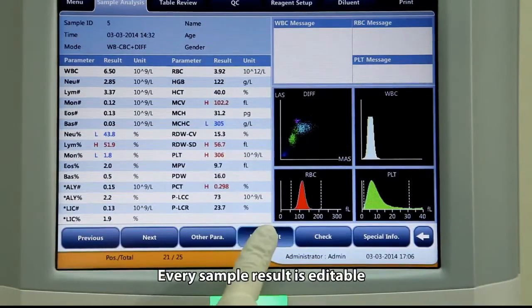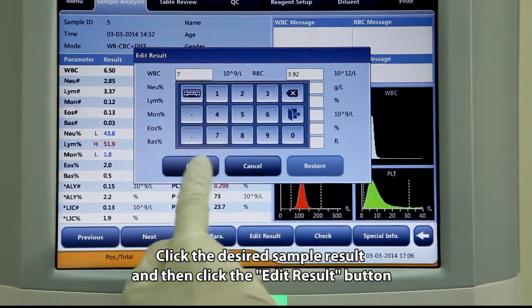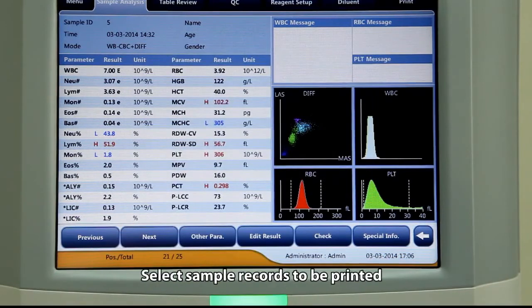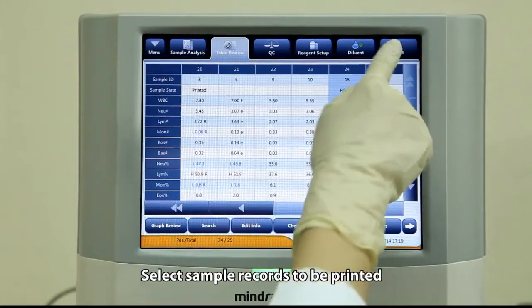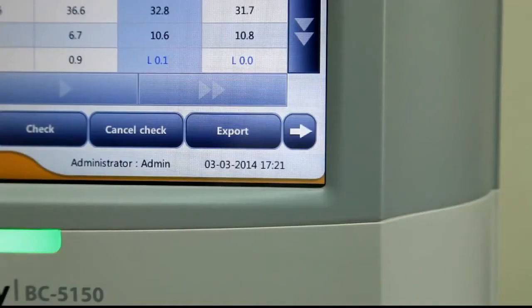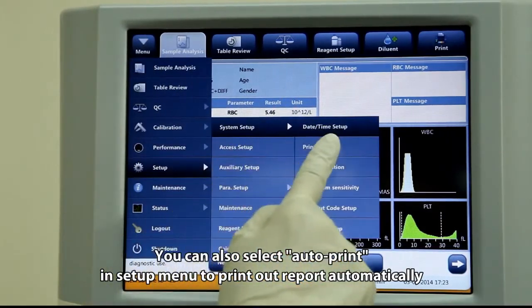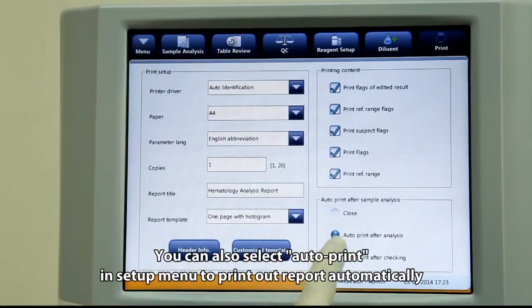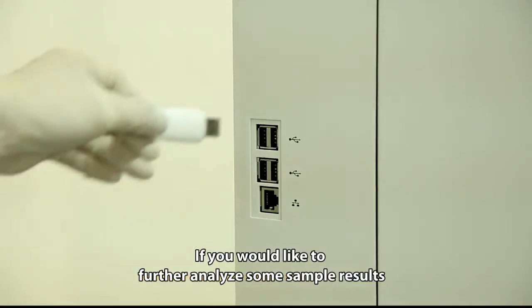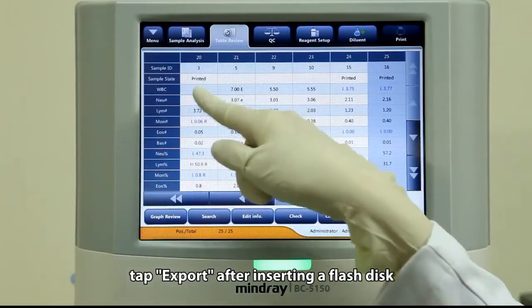Every sample result is editable. Click the desired sample result, then click the edit result button, modify the results, and tap OK to save the changes. Select sample records to be printed and tap print to print them. You can also select auto print in the setup menu to print reports automatically. To further analyze some sample results, tap export after inserting a flash disk.